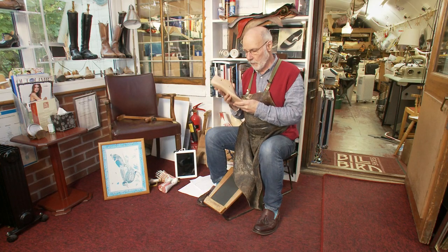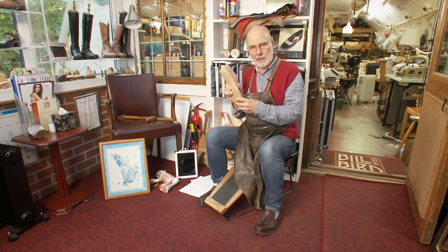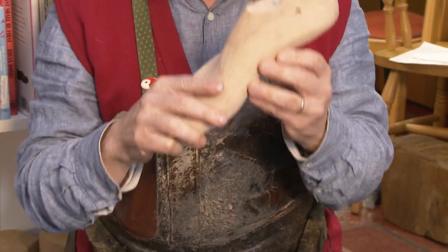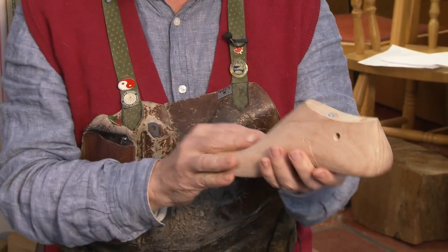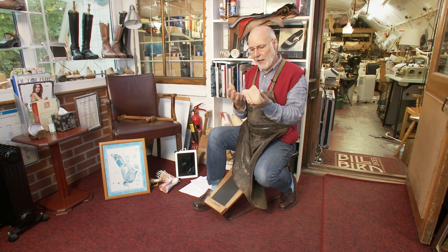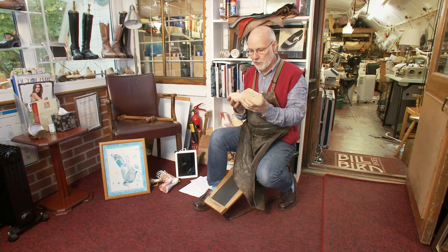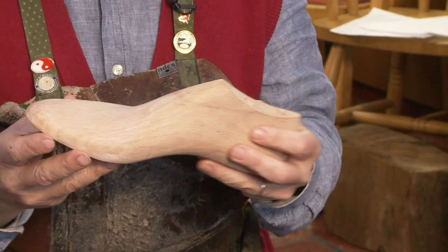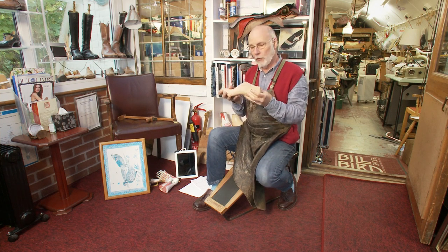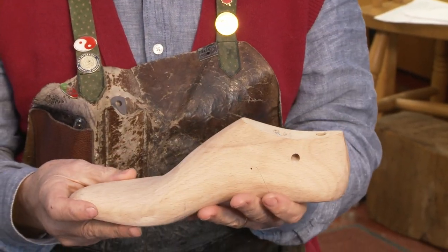This is a bespoke last, made for a particular individual with a particular foot condition — the toe shape they like, the heel height they want, and an overall feel. With bespoke orthopedic, there's a whole added dimension: some kind of foot problem. It could be a bunion, a hammer toe, a congenital deformity, or an acquired condition like rheumatoid arthritis, diabetes, or a road traffic or industrial accident where the foot has been damaged.